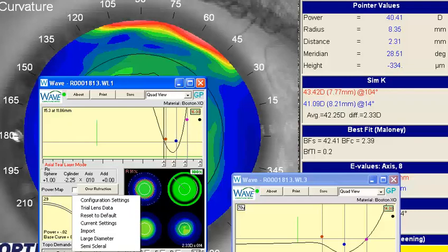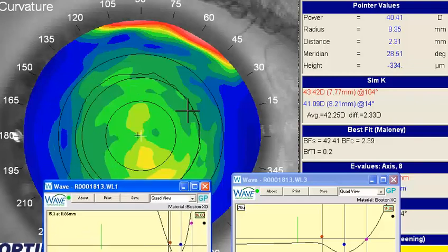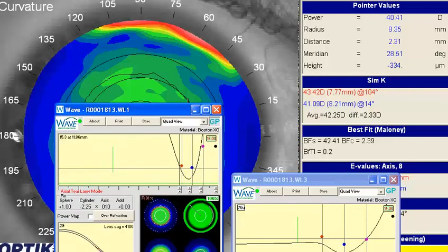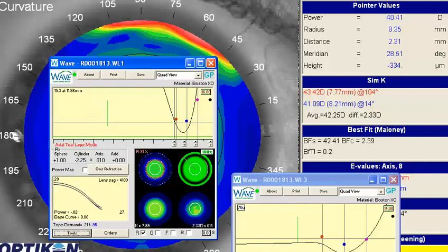With that said, let's move forward here for a minute. If we talk about the design, it sounds like the semi-scleral design was quite comfortable. Actually, the scleral design, the larger diameter, the 16, was more comfortable, but from my understanding, you're getting some scleral indentation up here. That basically suggests that that peripheral curve is too steep, and overall the entire lens is probably slightly on the steep side. So the fix for that is generally to flatten the entire lens, and that'll loosen up that peripheral curve so you don't have so much compression out there.